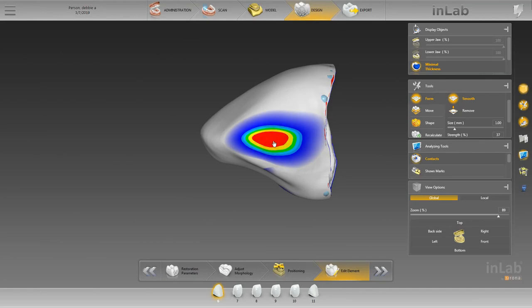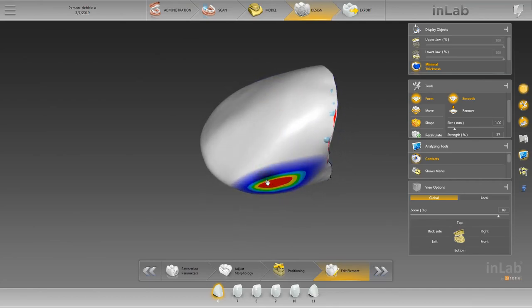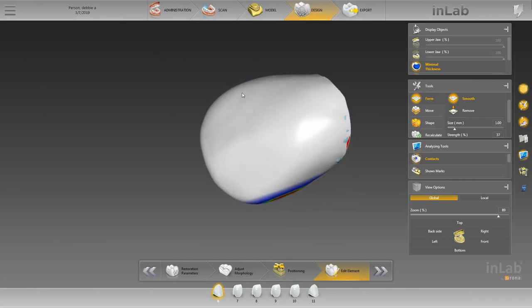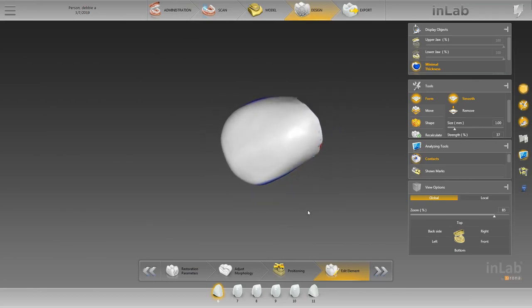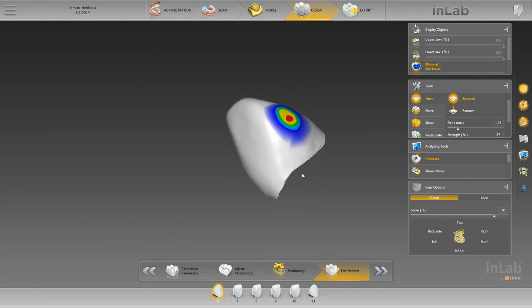Gonna flatten this surface out. And by flattening it out, you're gonna make it easier for you to draw the crown on and off, especially when it's adjacent to other crowns. So that's flat. We're good to go on that. And by refine the contour line, I mean finding that glare on it and then just smoothing it right along that glare.